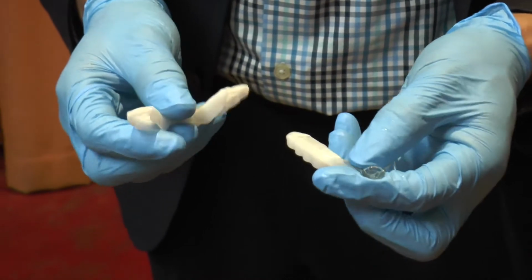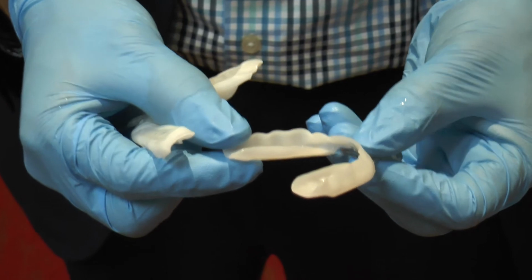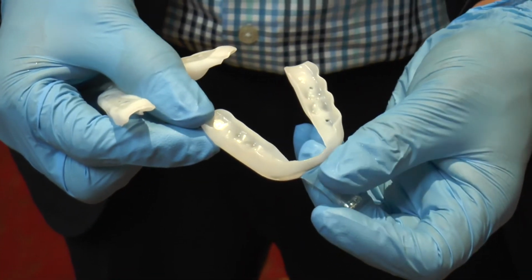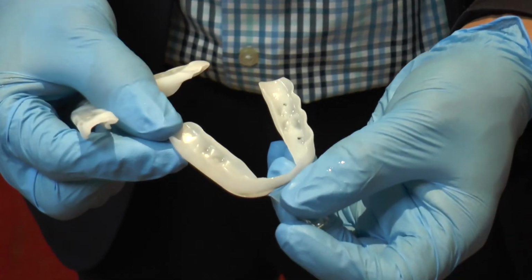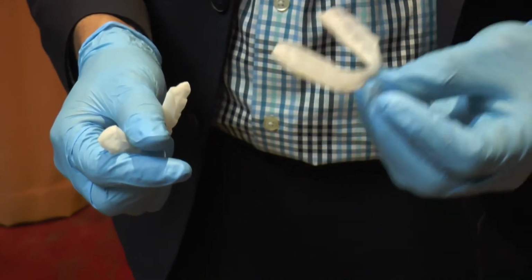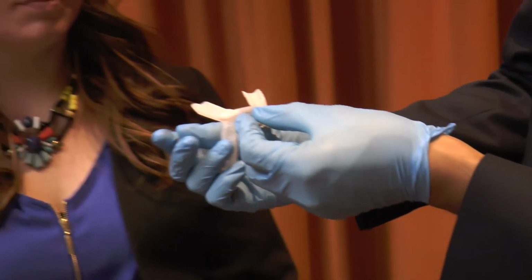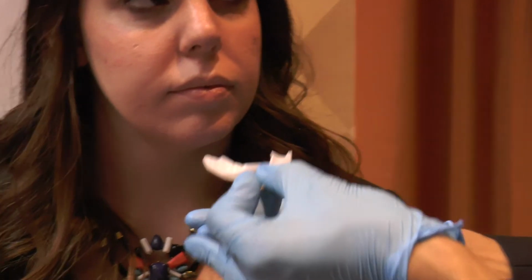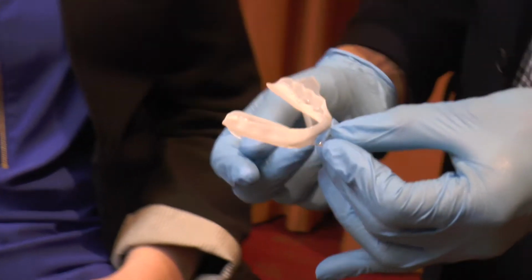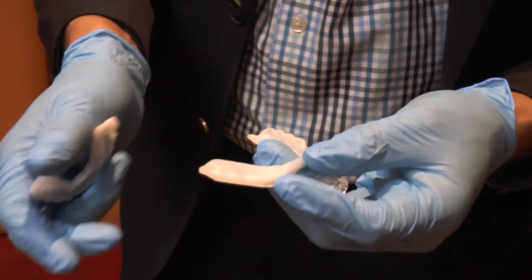The other note of concern is retention. The device does get tighter as this material cures. The curing can take up to 24 hours. If the patient experiences tightness, soreness the next morning, bring them back into the office, set this back in lukewarm water, partly soften it, take it back into the patient's mouth, and what you'll do is you'll seat it, remove it, seat it, remove it several times, and then let it bench cure. And what you'll try and do there is just to give them enough of a gap so there's not as much friction up against their teeth.